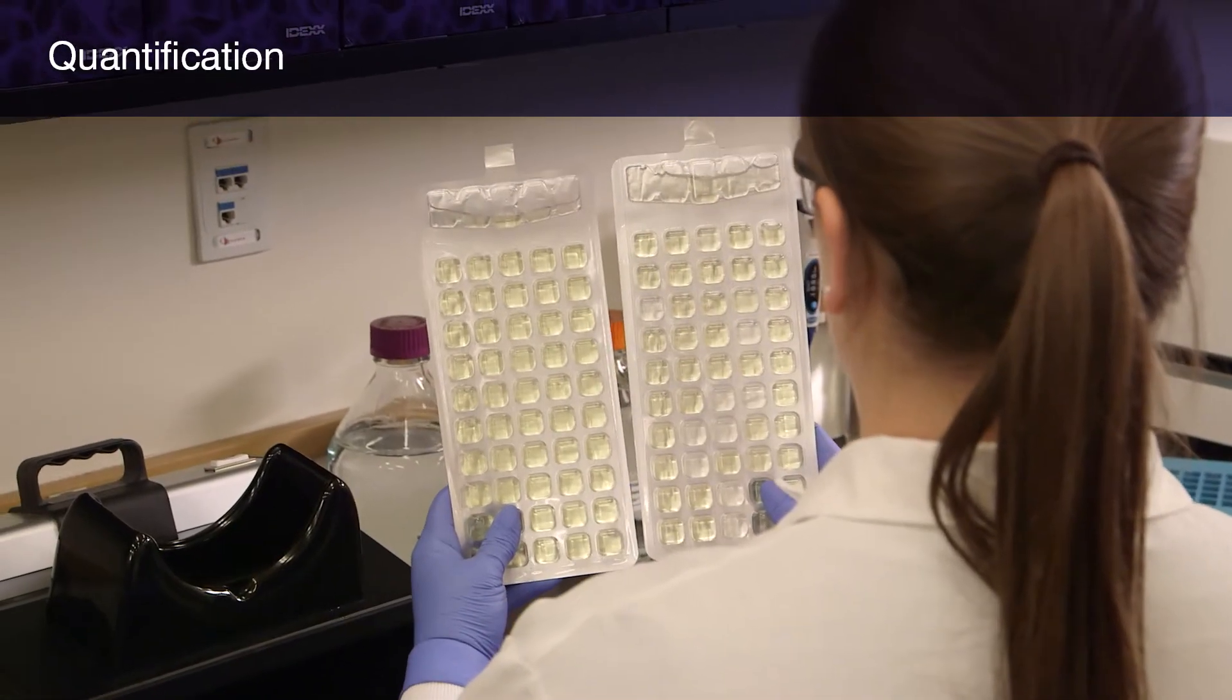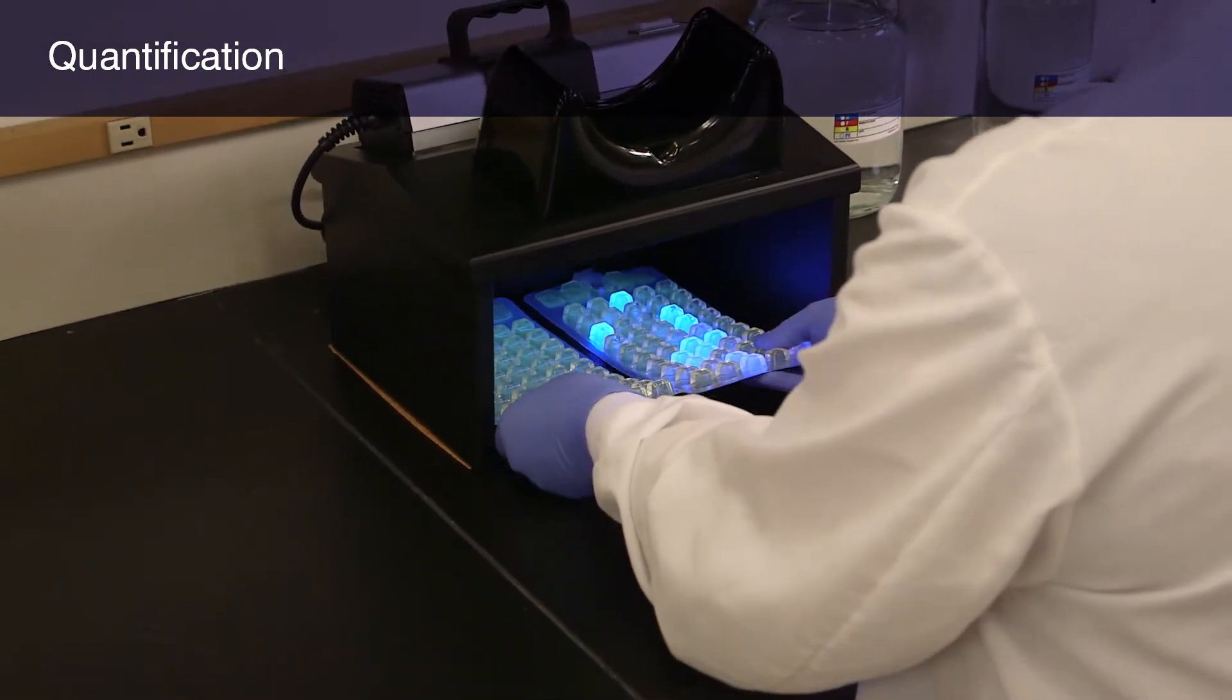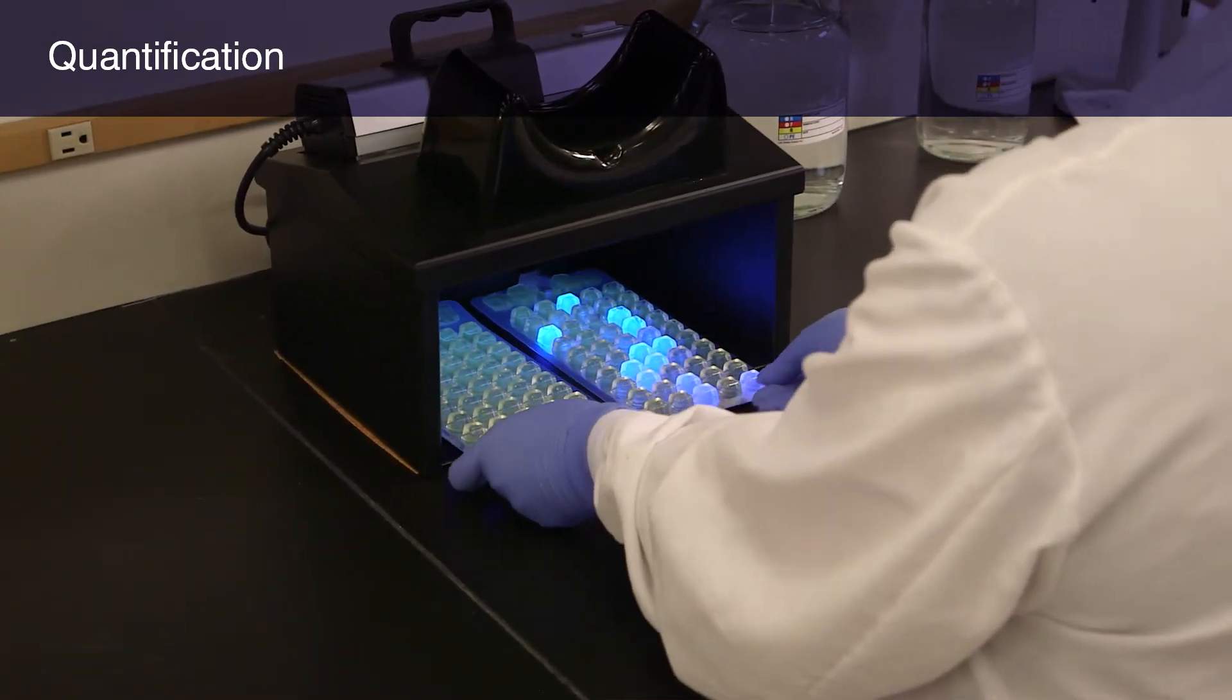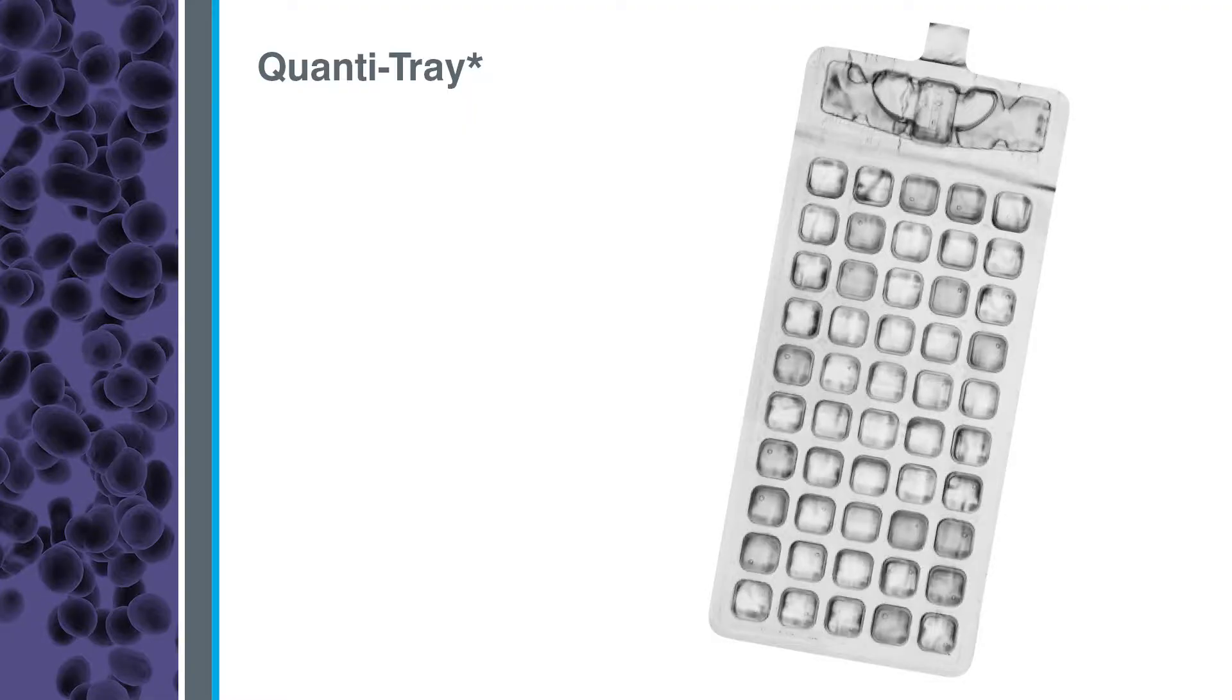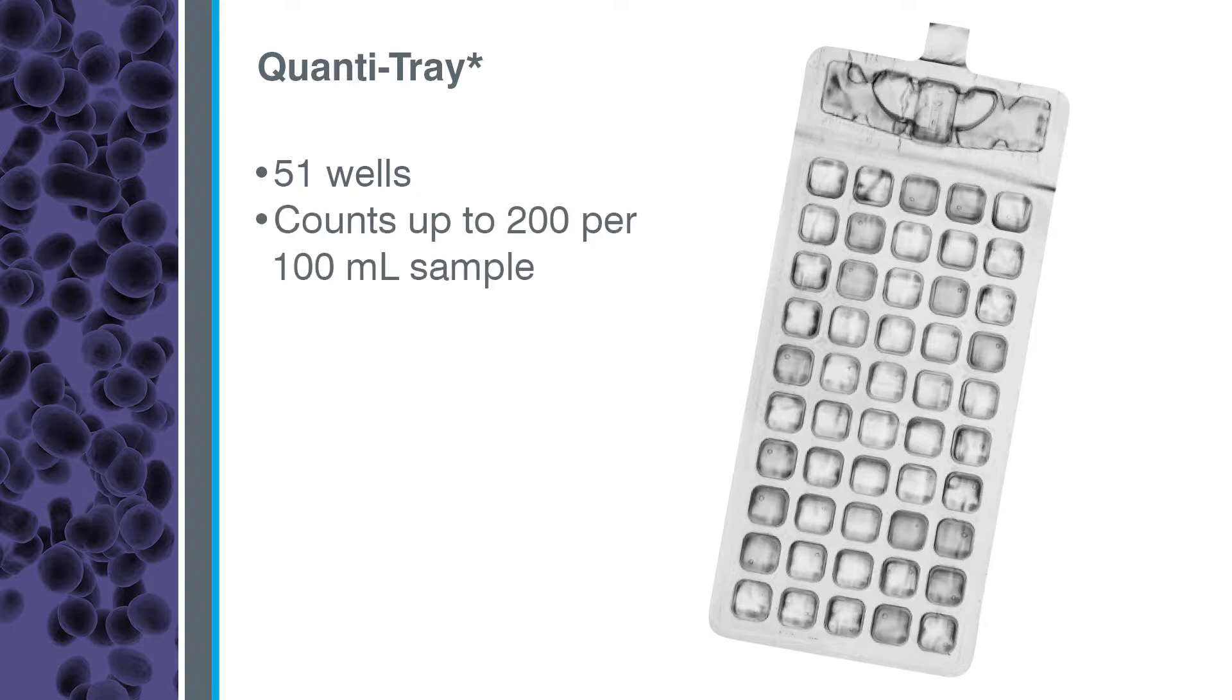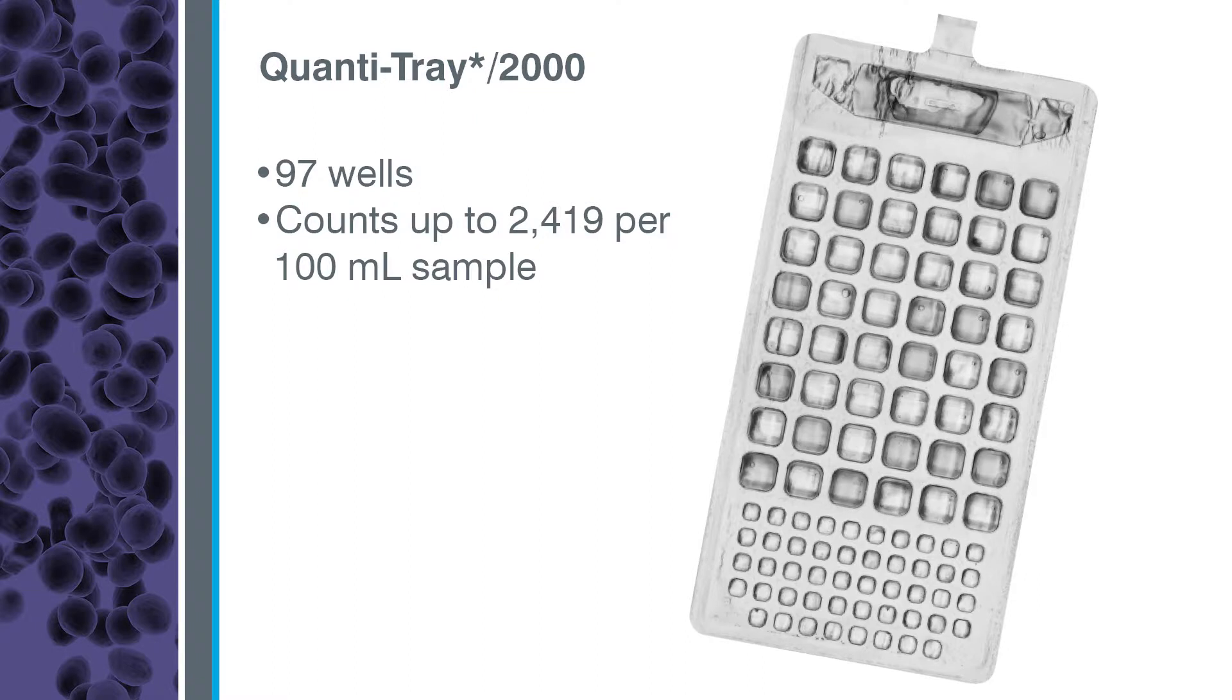Next, you'll learn to use the Entralert test with the Quantitray system to determine the number of enterococci in a water sample. IDEXX offers two sizes of Quantitray. Both work with the Quantitray sealer. The standard Quantitray is a disposable 51-well tray that provides counts up to 200 per 100 ml sample without dilutions. The Quantitray 2000 is a disposable 97-well tray that provides counts up to 2,419 per 100 ml sample without dilutions.